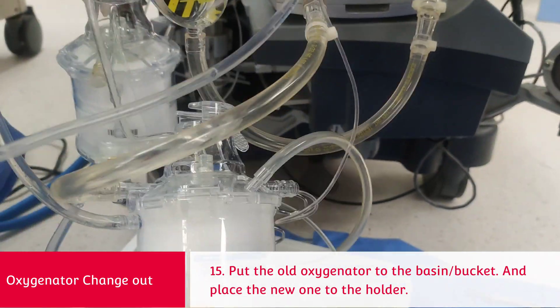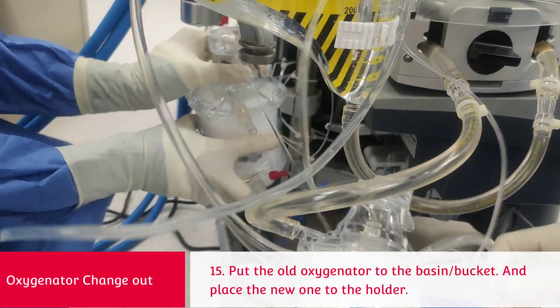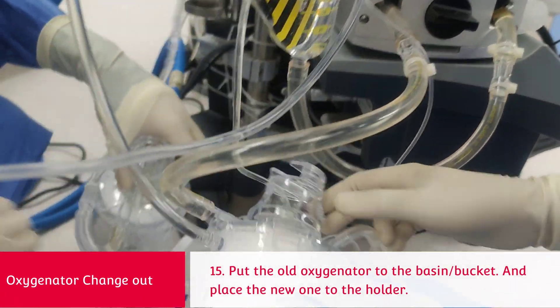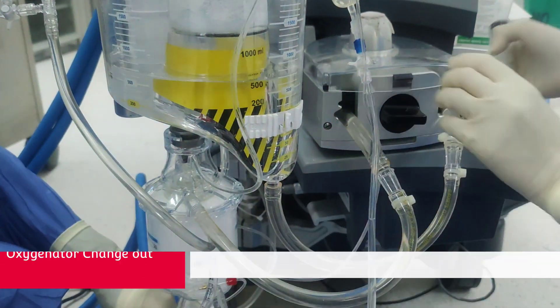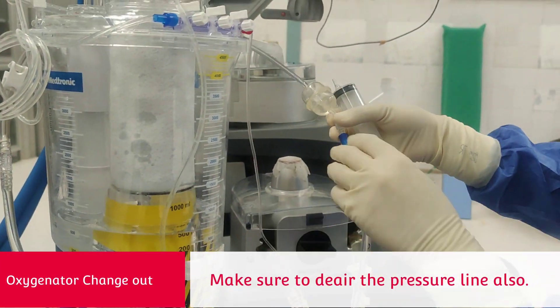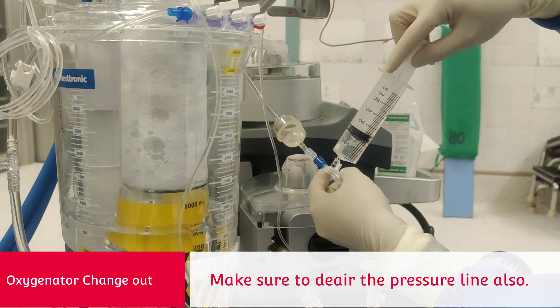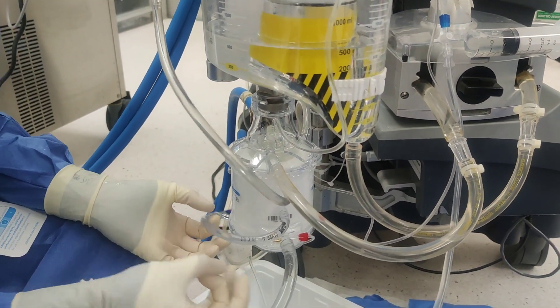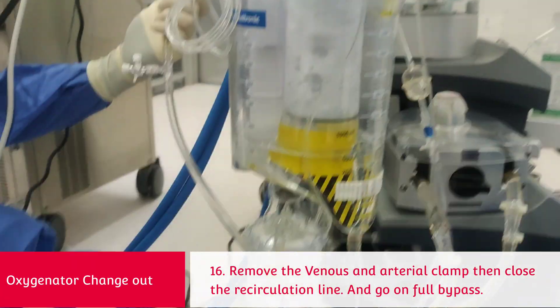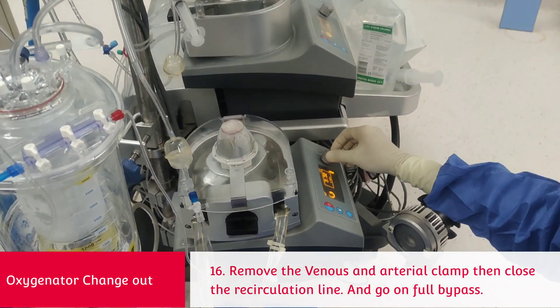Remove the old oxygenator from the holder and place the new oxygenator into the holder. De-air the pressure line as well. Close the recirculation line and remove the venous and arterial clamps. Announce the initiation of bypass and go to full bypass.